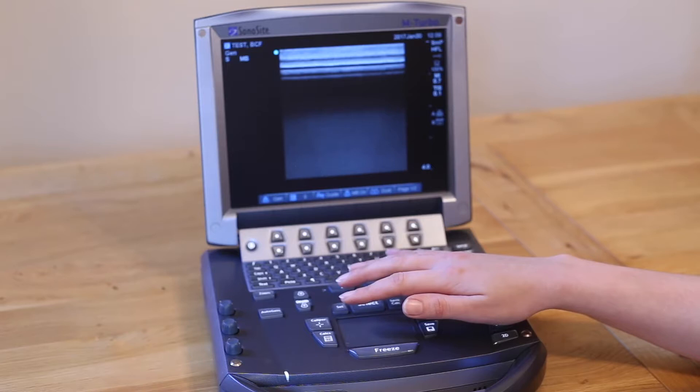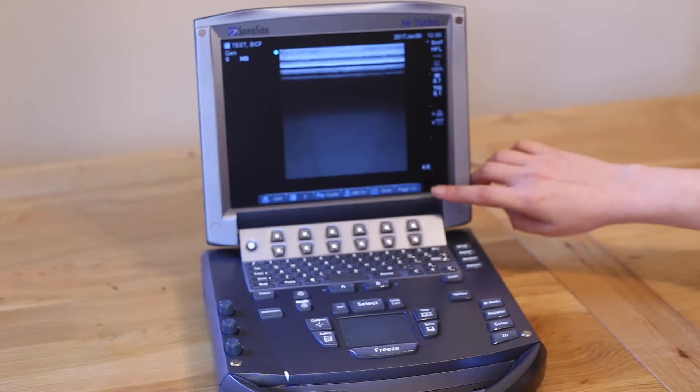When using the linear probe on the screen, the image will get wider or narrower depending on the depth that you're at.